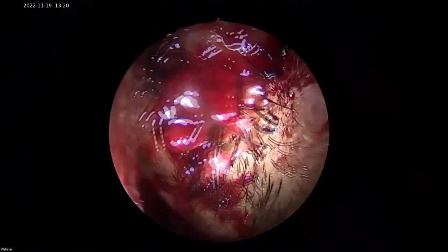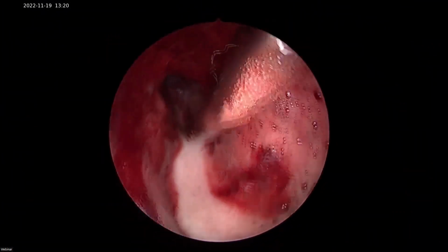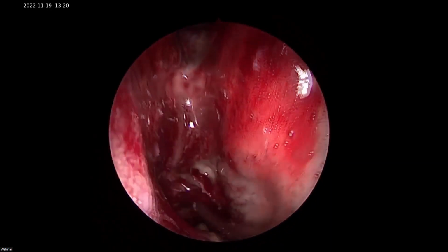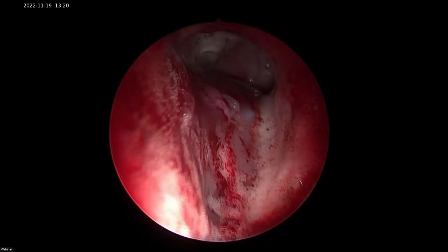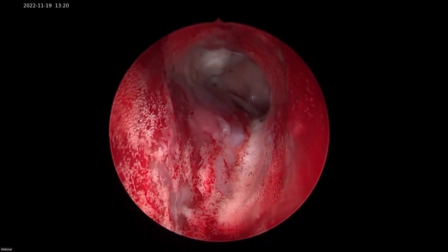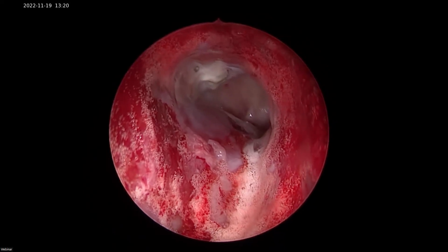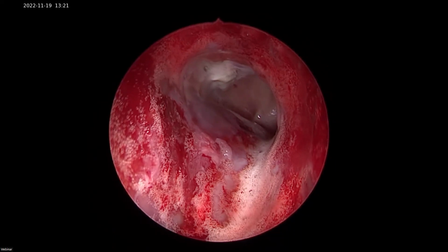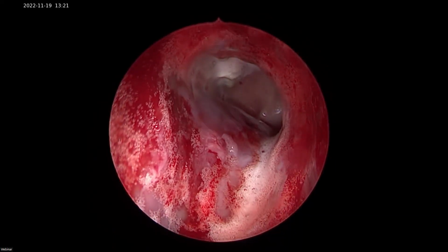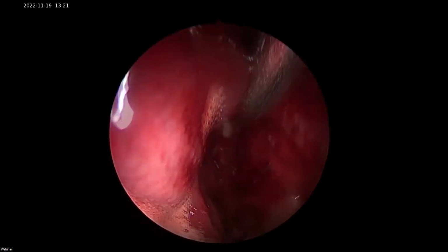But my problem is that I don't have a 90-degree suction here. I know that with 90, when I feed it, it will come out. But the catheter is going through the suction and touching. It is so badly stuck, it's just not coming out after the wash also.